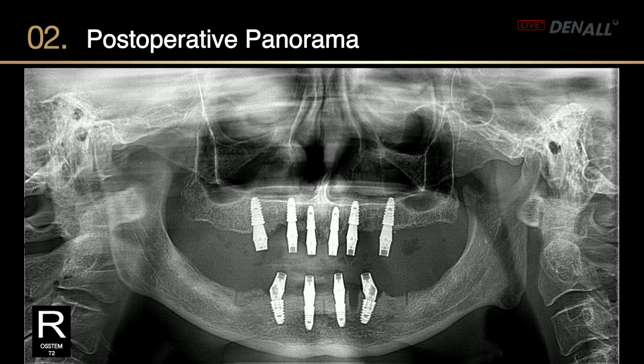The panorama looks good. Actually, I am given the chance to do a lecture by Osstem through an analog approach, but using digital dentistry, the predictability and completeness of the treatment would be improved. So using the digital dentistry system, more challenging cases can be tackled with a digital approach.